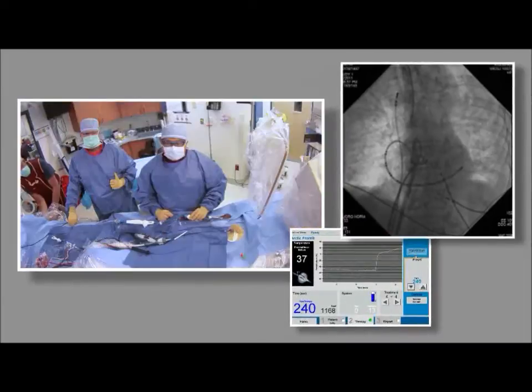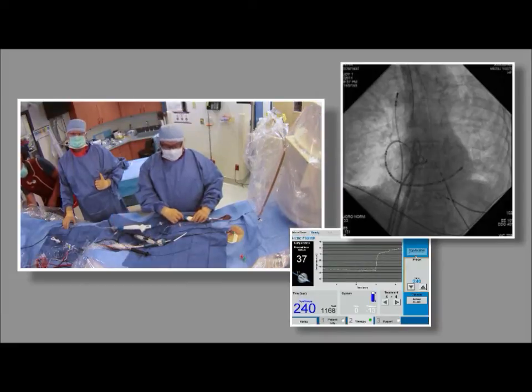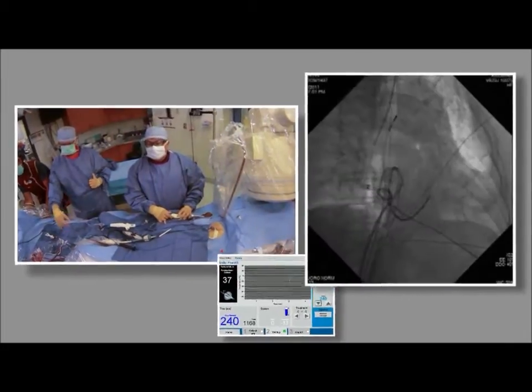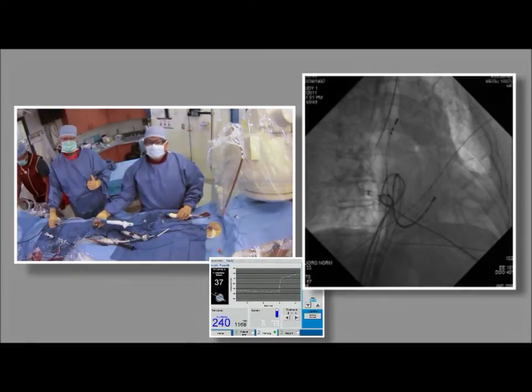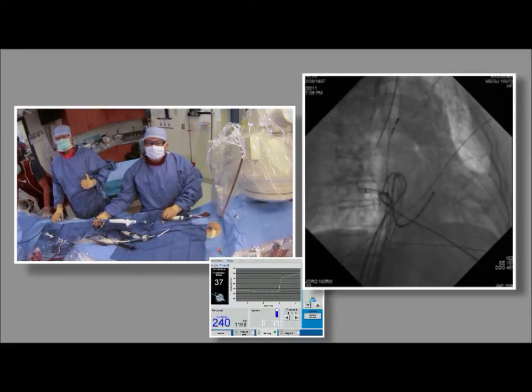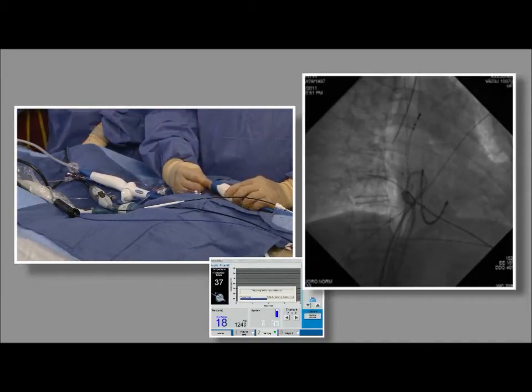In LAO, I know I'm toward the right side. Come to RAO and make sure this is pointing posteriorly. On the right side, we have to pull the balloon past the bend on the sheath. The balloon is all the way back and will go forward — that's the right inferior vein. We're going to track the balloon over wire. Dr. Hsu is now advancing the balloon over the wire into the right inferior pulmonary vein.